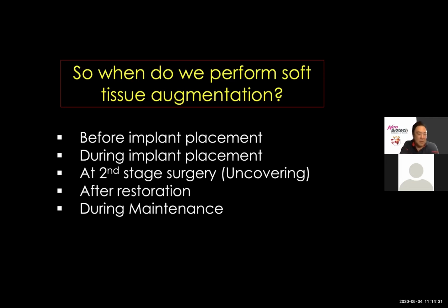And I can be the first to tell you, in my practice where I have been seeing implant patients for a number of years, I'm actually doing a lot more soft tissue augmentation procedures today than I was, say, 3-5 years ago. Just paying more attention to the need for having stable soft tissue support. So I'm doing a lot more free gingival grafts, connective tissue grafts around implants that have already been restored, because I'm seeing the recession effects from having a thinner biotype. So we definitely do need, I think, to understand the basis and the foundation necessary to be able to have that successful case long-term, aesthetic-wise, for our patients.